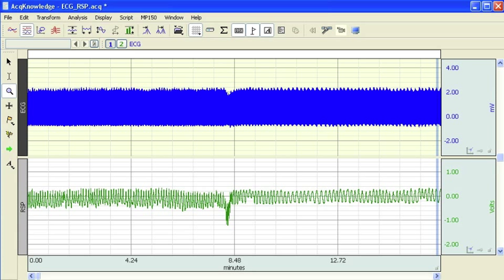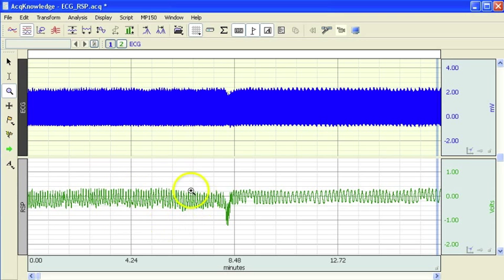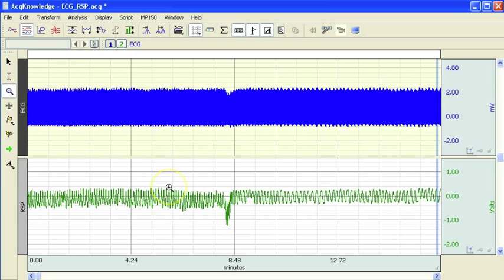It uses a recorded lead-to ECG waveform which we have here in the top channel and also a respiration signal. This was recorded using a Biopac TSD201 respiration transducer.